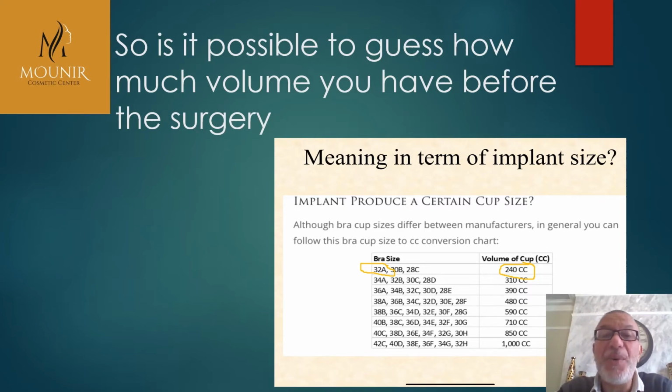Yeah. So really achieving the cup size that the patient is asking you to achieve, you need to know, you need to measure the breast, the width of the breast, the height of the breast, you need to measure the cup size. You need to make sure that you know how much volume she has before you give her the implant, so that you can say, look, if we do this implant, you will more or less achieve the cup size you want to have.